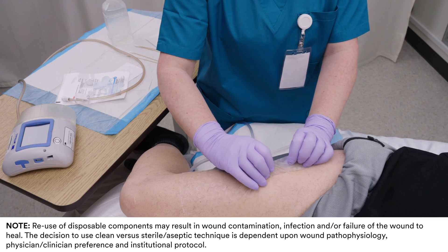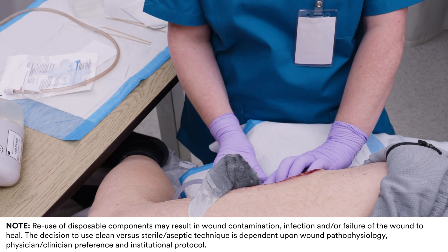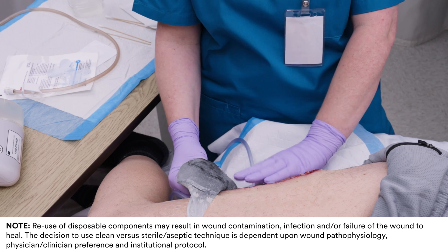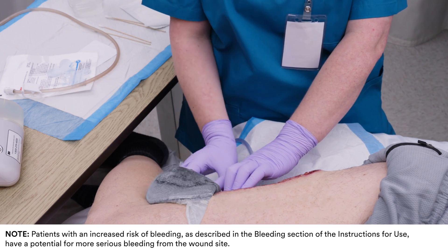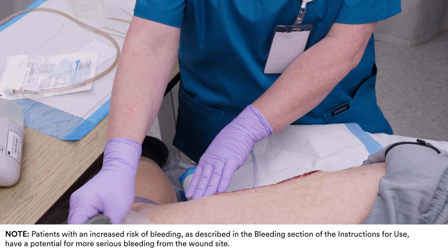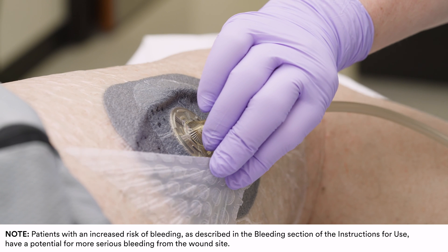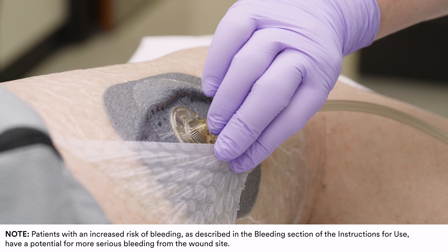When the therapy has been completed and the dressing disconnected from the unit, gently remove it from the wound. Regardless of treatment modality, minor bleeding may be observed, and the wound bed may show some proteinaceous or fibrinous materials. Clean the wound according to the clinician's discretion. If the dressing adheres to the wound, consider introducing sterile water or normal saline to the dressing.